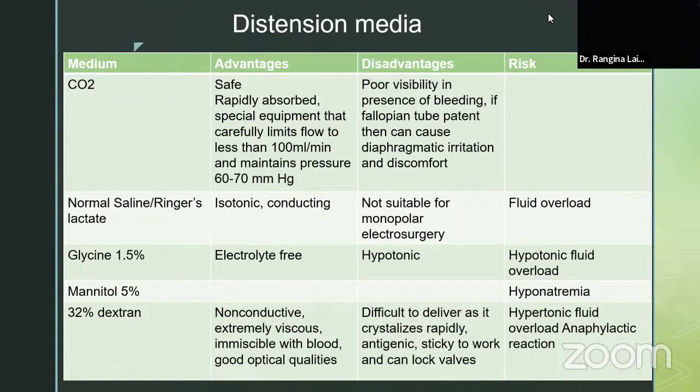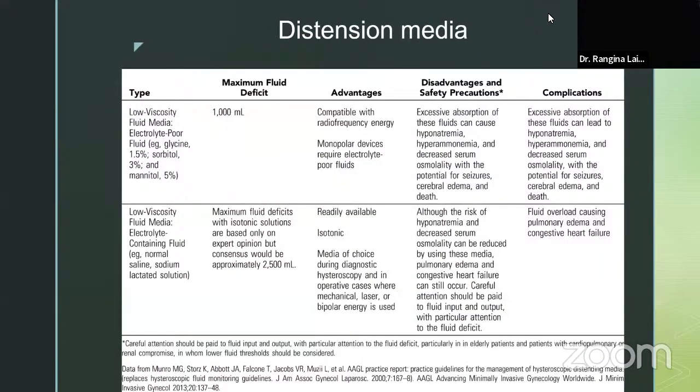So many of us, even the companies who are bringing out the hysteroscope, have stopped promoting monopolar electrosurgery. Usually I think all of us who are listening today agree that we are using bipolar, with normal saline. I personally prefer bipolar with normal saline.